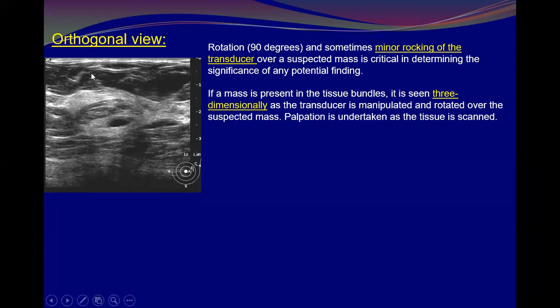Yes, the parenchyma here is definitely going parallel, then here it is elevated. Humping, so it can be palpable, a smooth palpable area. A large area of palpable abnormality can be here because it is a little bit elevated from the rest of the parenchyma. Here it is not as parallel as the rest of the parenchyma.